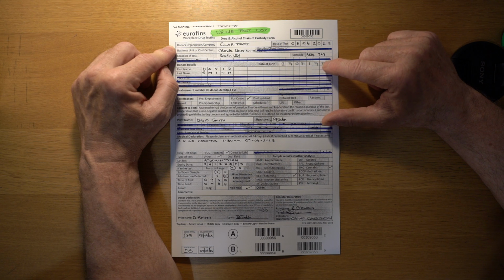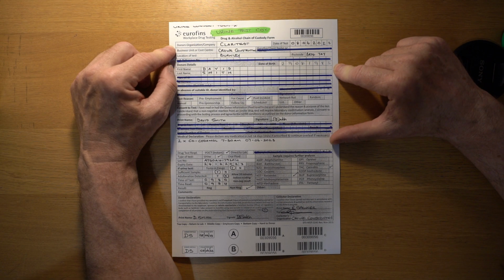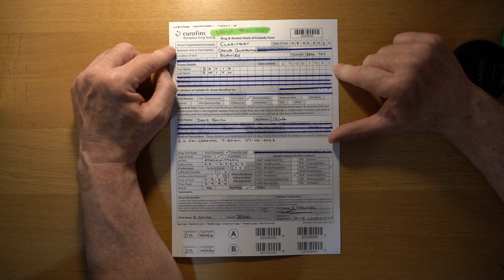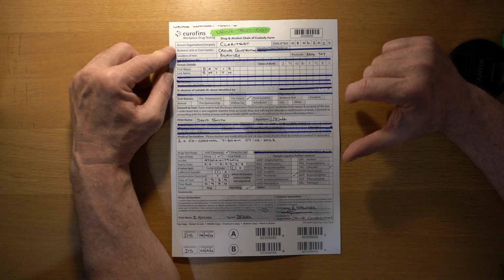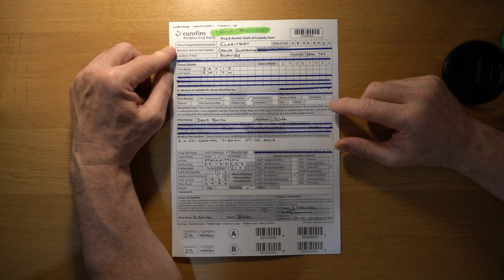So underneath that, donor details, date of birth 29th of the 8th 1985, and then first name and last name David Smith. I've already crossed out some of the things you don't need to put in here. These I've covered up over here with things you don't need, like donor identification. You know that the person sitting in front of you is the person you're supposed to be testing, so you don't need to put anything about identification of donor there.